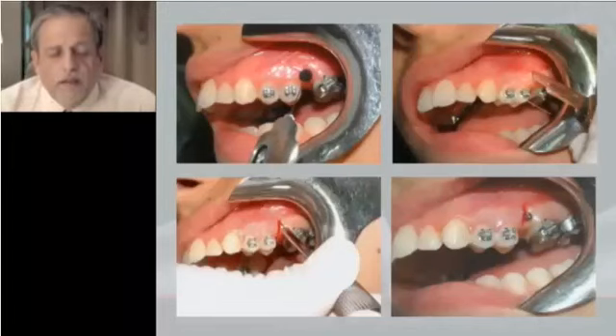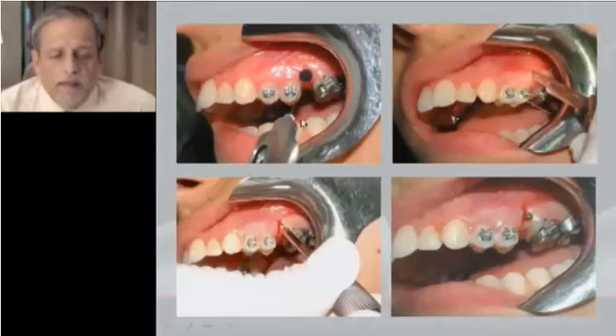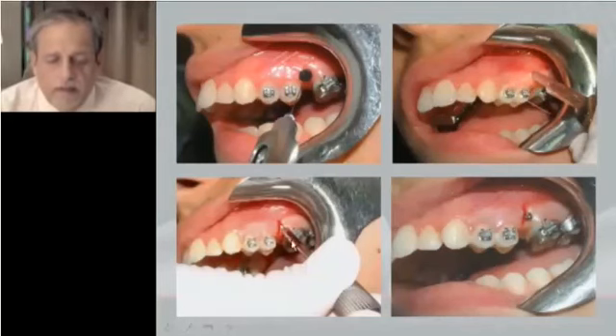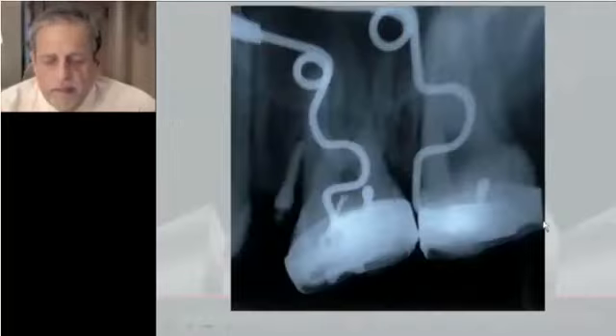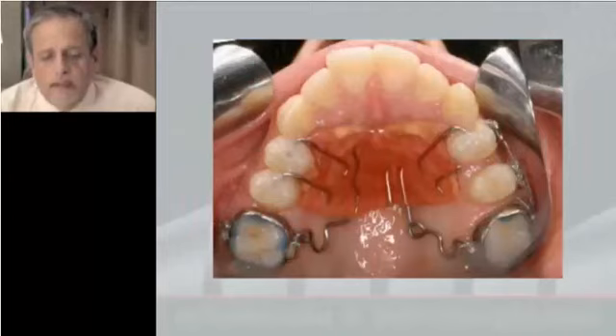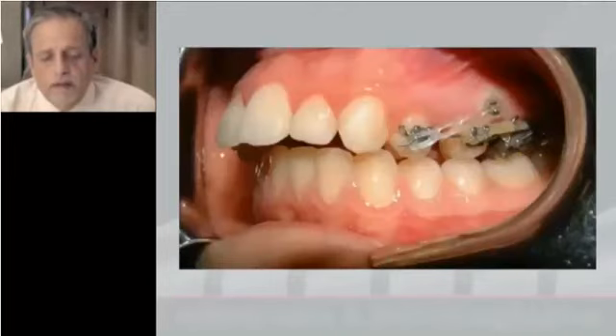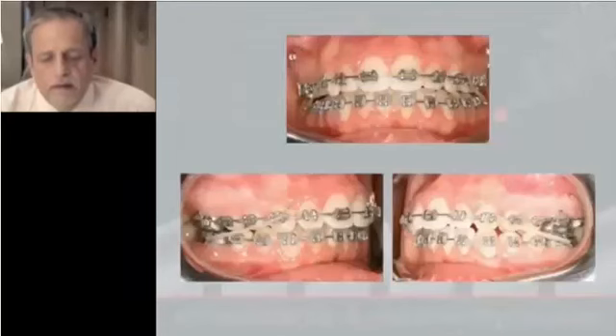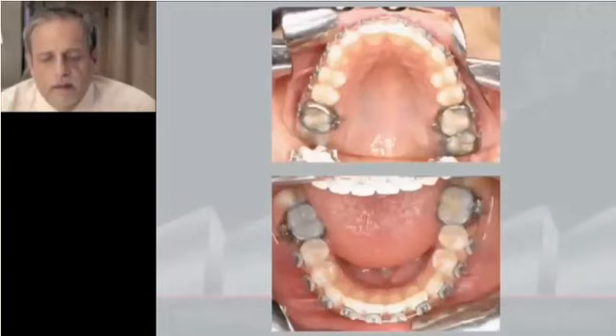After the distalization of the molar, we insert a micro-implant measured to the molar. Anesthesia and mucosa measurement, using the scalpel to separate the soft tissues, and then inserting the micro-implant. X-ray control, and then using a sectional wire and elastic, we distalize the bicuspids and then complete the case.